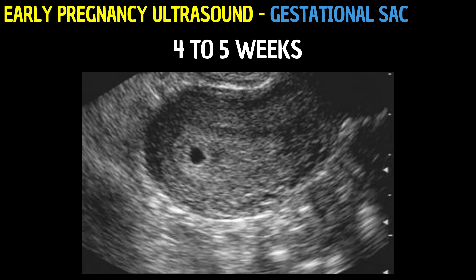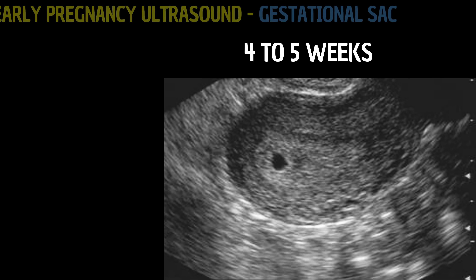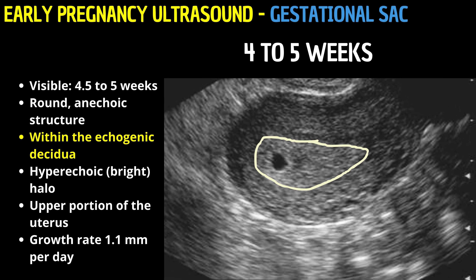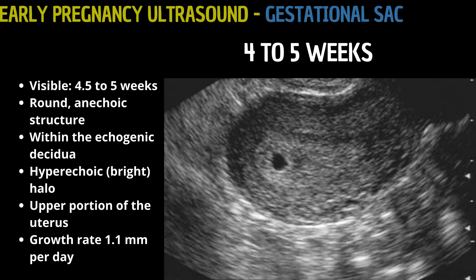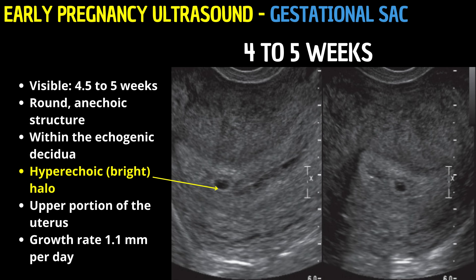In this initial phase of pregnancy, our focus is on the gestational sac, the earliest ultrasound evidence of a pregnancy. By approximately 4.5 to 5 weeks of gestational age, the sac becomes visible on transvaginal ultrasound as a round, anechoic structure. It is situated eccentrically within the echogenic environment of the decidua, the uterine lining that has thickened in response to pregnancy. A key feature of the gestational sac at this stage is its hyperechoic halo, a result of the decidual reactions surrounding the sac, providing a stark contrast to the anechoic fluid-filled sac center.